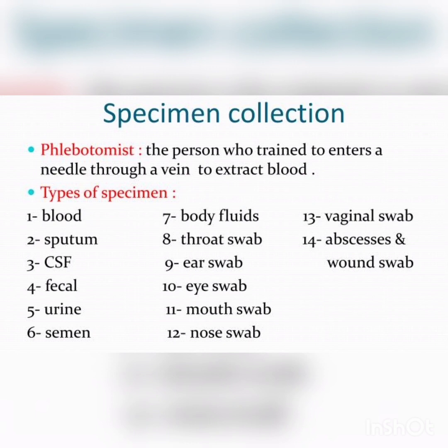And then some bacteria such as meningococcus in CSF, that is cerebrospinal fluid, are very sensitive to low temperature. So they require immediate culturing. Especially meningococcus is a bacteria which can cause meningitis.